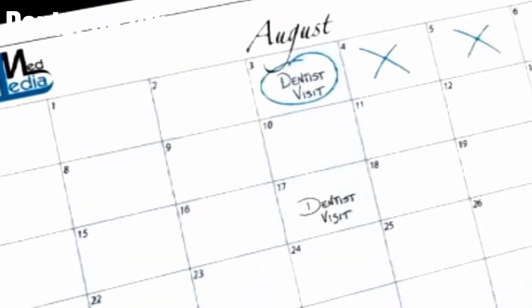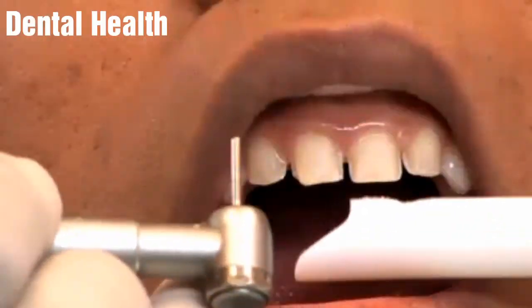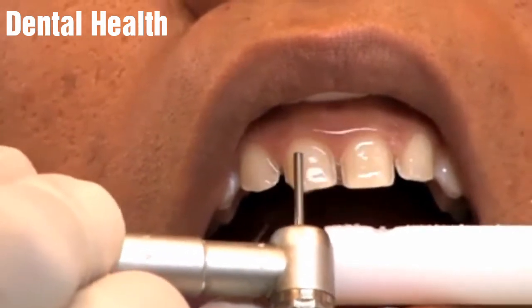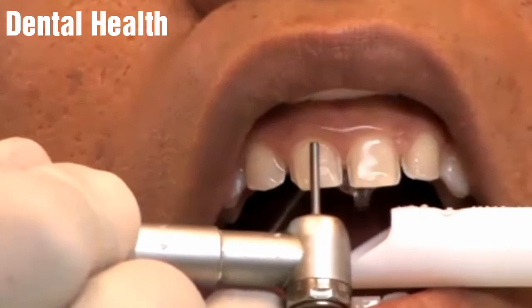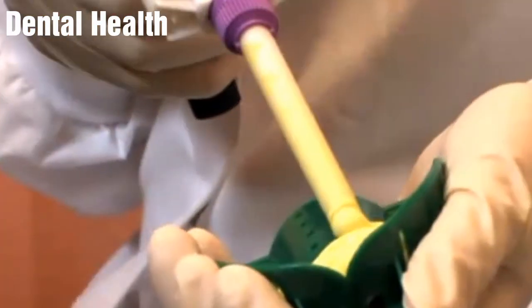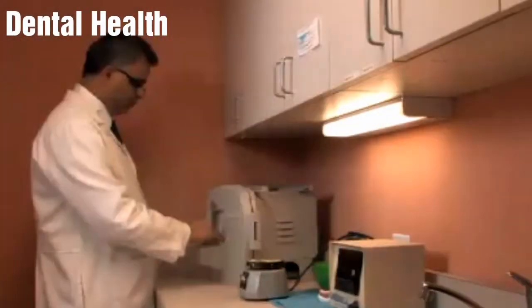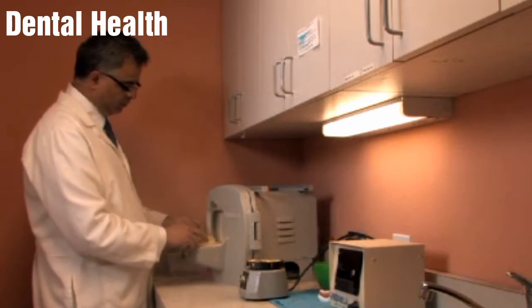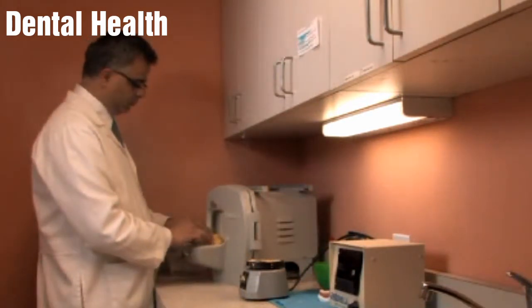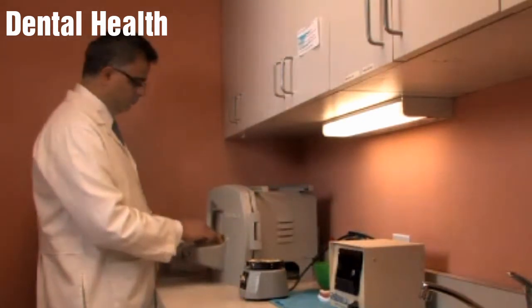It normally takes 2 visits for your dentist to complete your veneers. If preparation is necessary, on the first visit, your dentist will use a dental handpiece to shape and prepare the teeth so the veneers will properly fit over them. Next, an impression of your teeth is taken and temporary veneers may be placed to protect the prepared teeth. The impression of your teeth is then sent to a dental laboratory where custom-fit veneers are made. During this first visit, your dentist will also help you choose the proper shade for the color of your veneers.